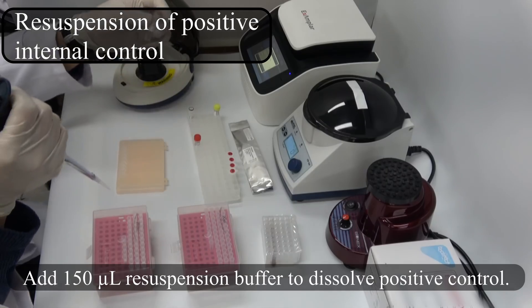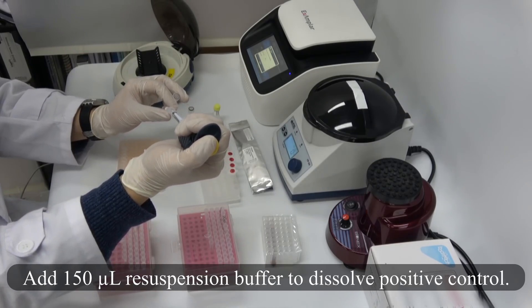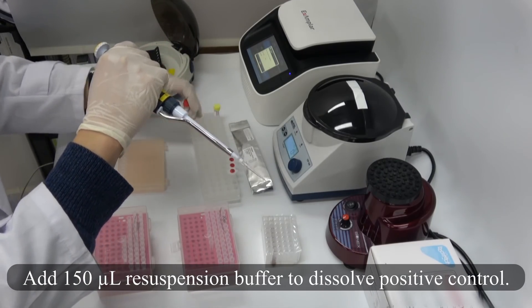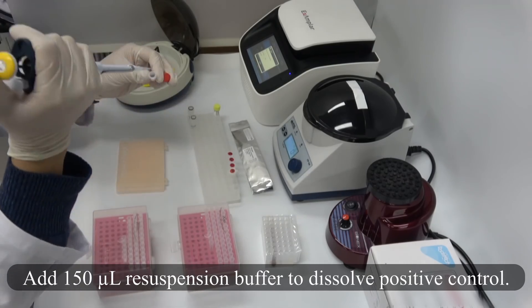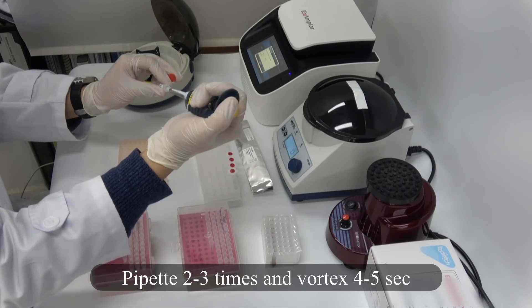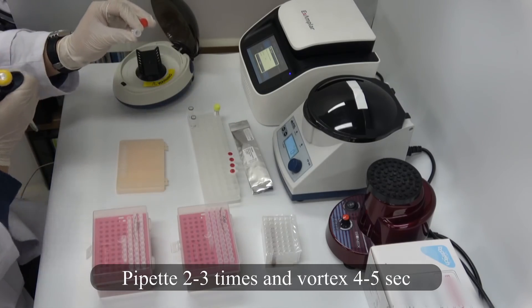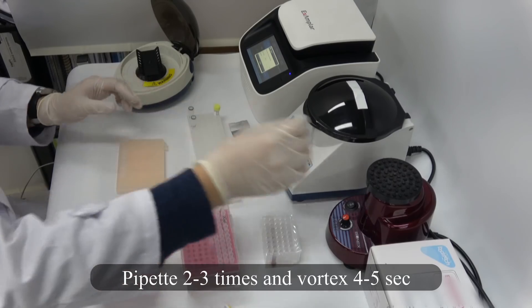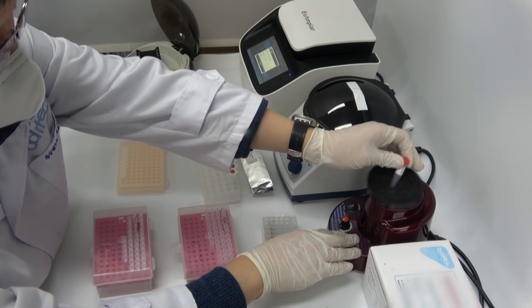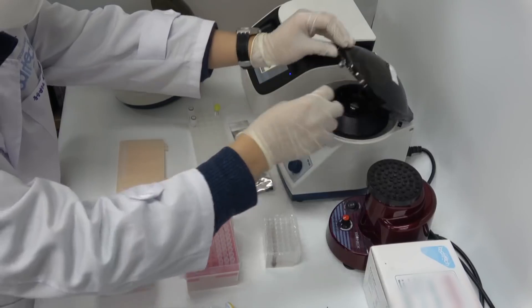Add 150 µL resuspension buffer to dissolve the positive control. Pipet 2 to 3 times and vortex for 5 seconds. Spin down briefly.